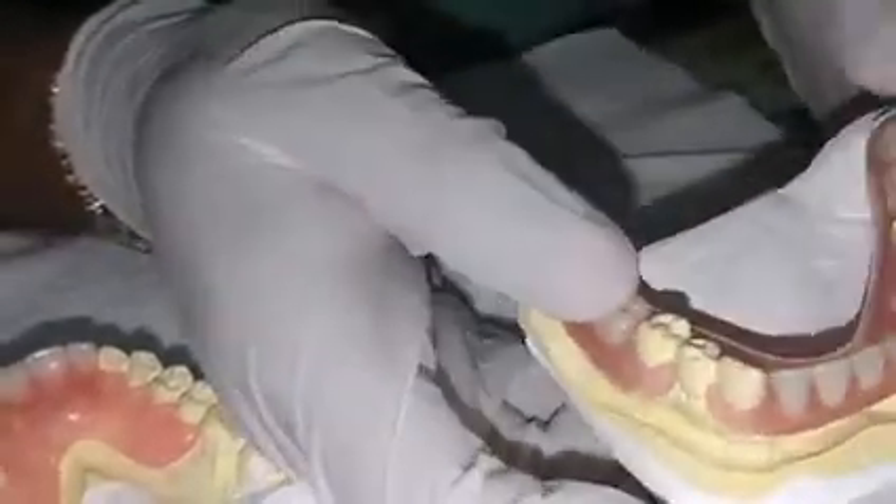You can notice the sound and here also you can see it is having very good retention. This is a flexible denture, so they can wear it comfortably.